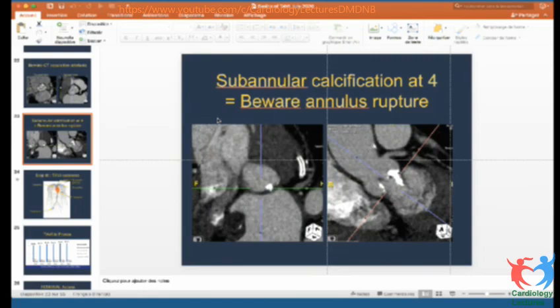Yes, you know, sometimes you have aortic stenosis without a very large amount of calcification on your valve. If your valve is not very calcified and you put a balloon expandable, it could embolize. You could have migration of the valve. Sometimes you have more aortic regurgitation and a little bit of stenosis. So if your valve is not very calcified, even with your balloon expandable, you could have migration.